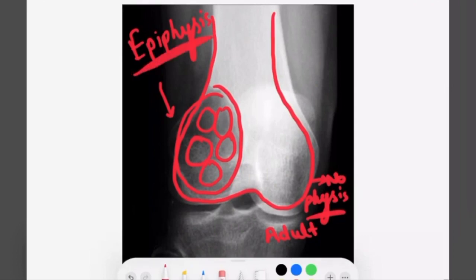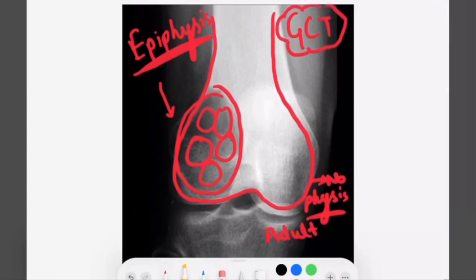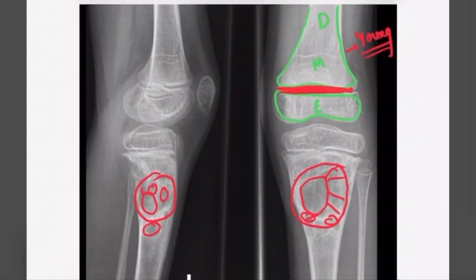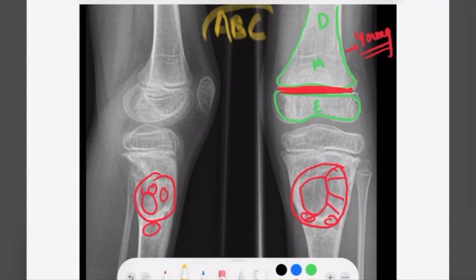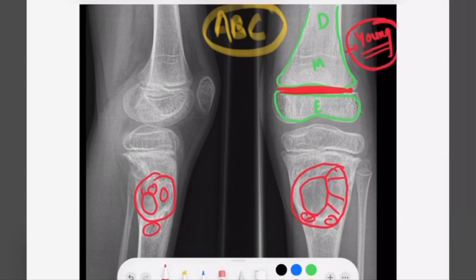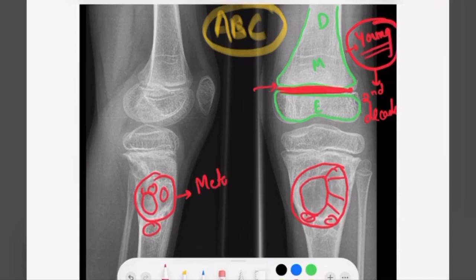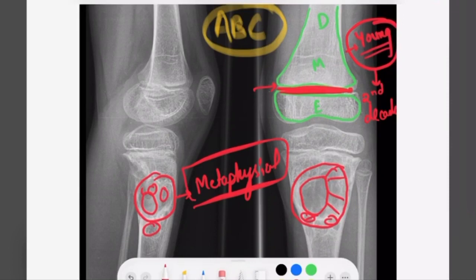So this X-ray is of GCT. Coming back to the previous one, this is an X-ray of ABC, because we have a young patient of around the second decade and the physis is present. The site of the lesion is metaphyseal in origin — this is the characteristic of ABC.